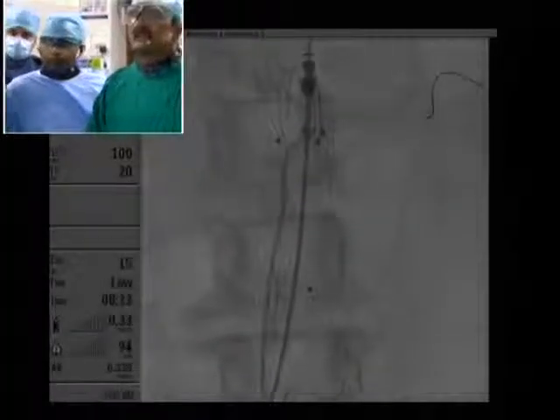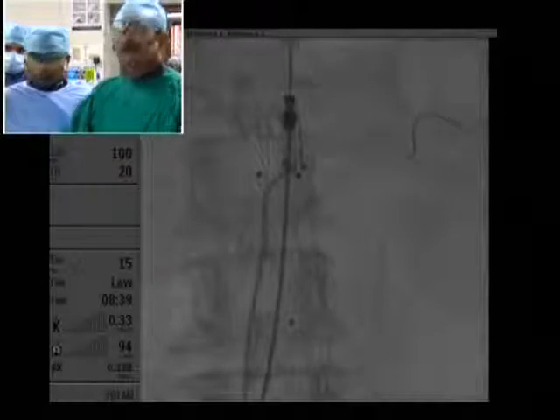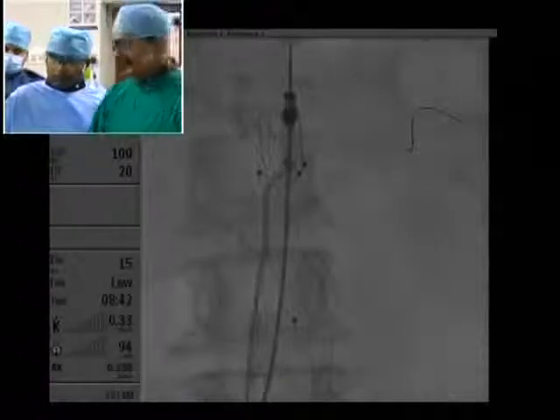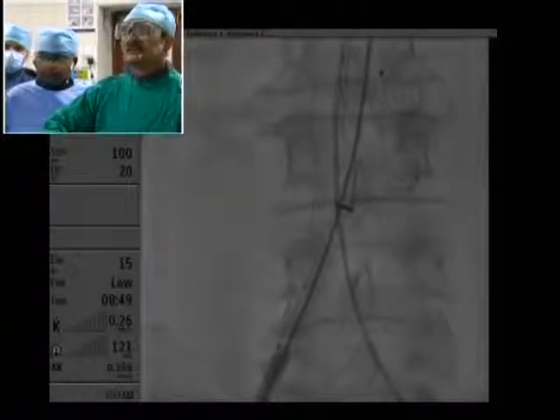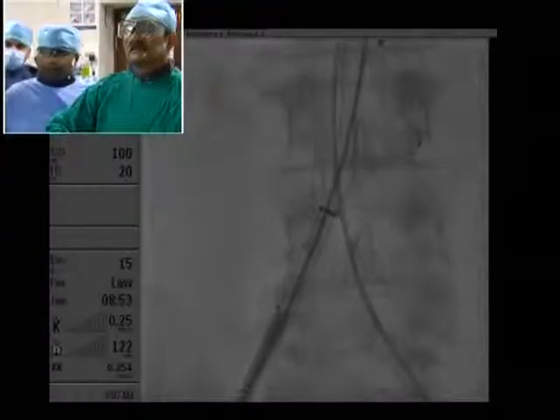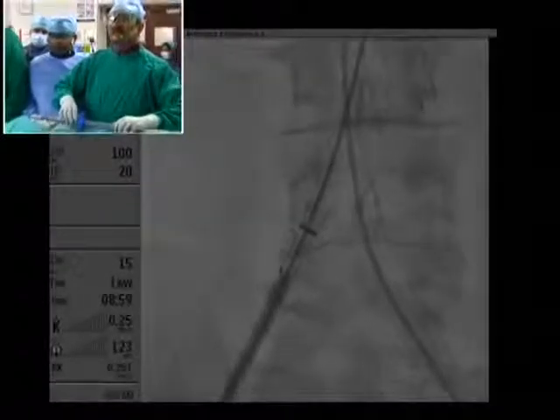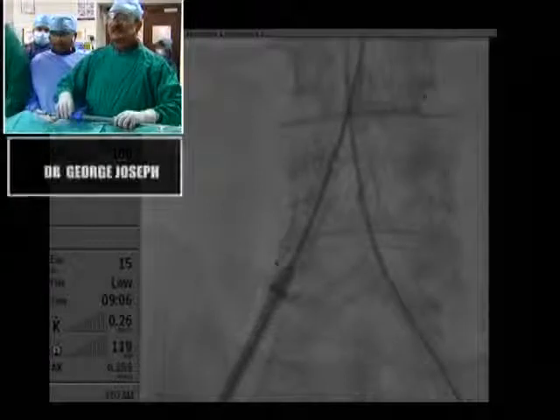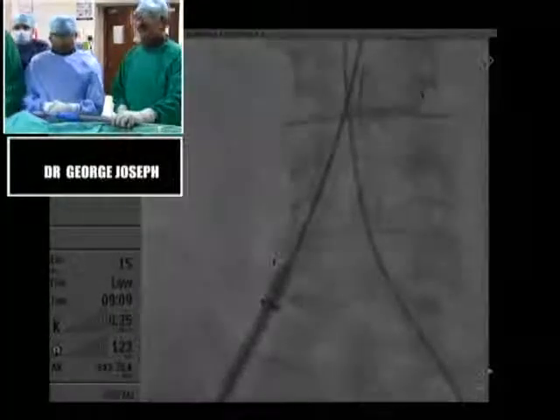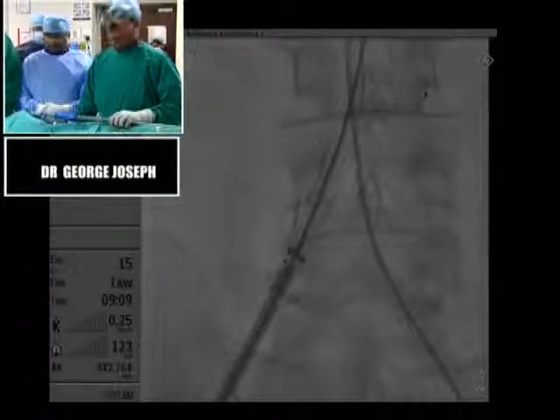So we'll just check the renal, and then we'll remove the renal catheter. Center the renal. The renal is flowing very well. I'm actually maybe 1 or 2 millimeters below that. So we can take that off later. So show the lower end now. I'm continuing the release, and I'm going to finish the release on the ipsilateral iliac side. Okay, so the release is completed now, and the next thing is to get this delivery system out. So show the top again.